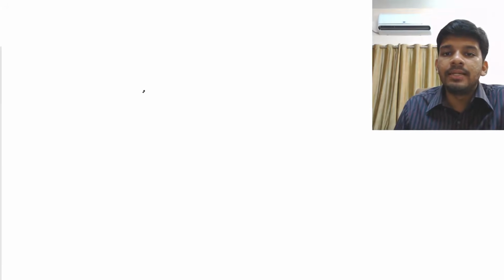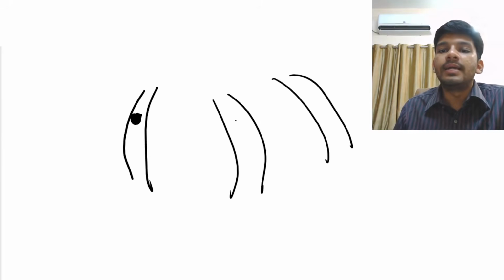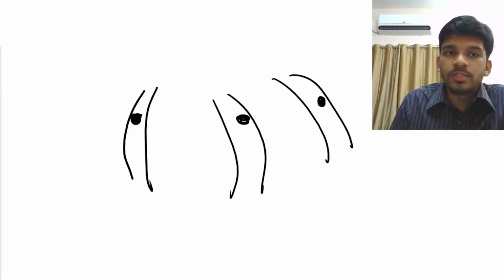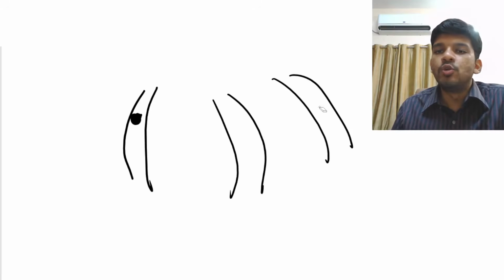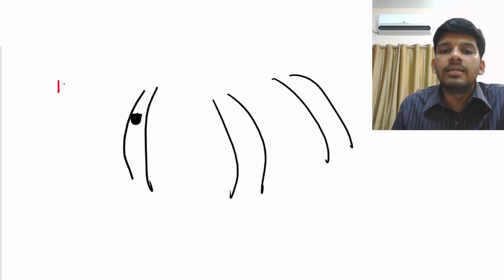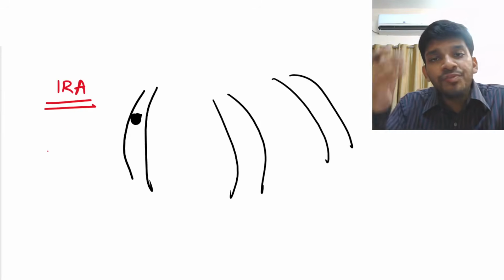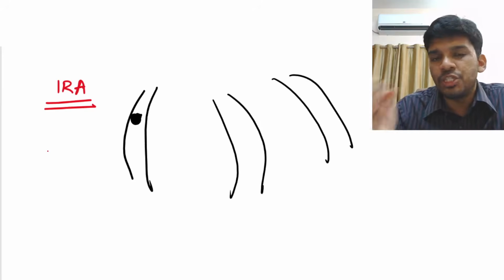So in an MI, it is assumed, especially in ST elevation MI, that there is an acute occlusion of one artery. It is very unlikely that there are multiple arteries developing critical occlusions at the same time. That is the funda behind all this. So in all MIs, it is assumed that there is only one infarct-related artery, called the IRA, which we have localized using the ECG.